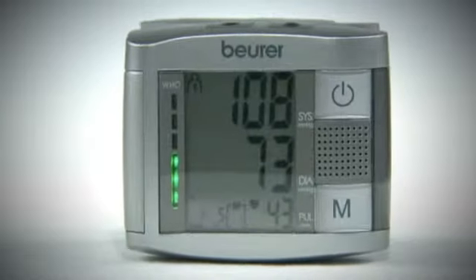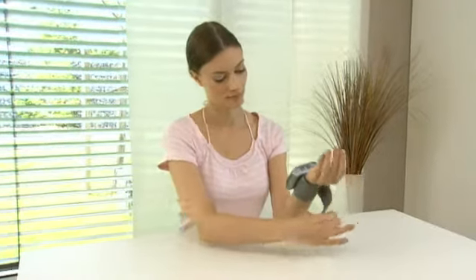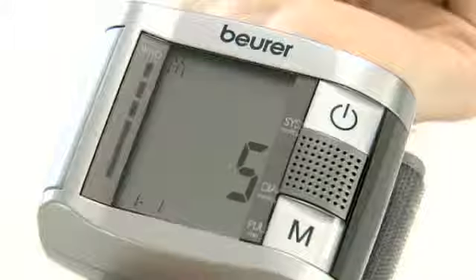Measure your blood pressure safely and easily with the speaking function. Simply applied to your wrist, the BAR blood pressure monitor reveals your automatically measured blood pressure via a speaking function as well as a large LCD display.